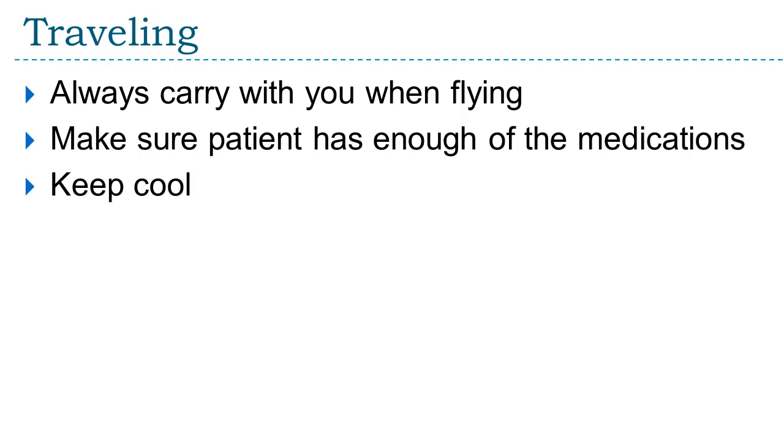It's usually administered at a basal rate of about 0.5 to 2 units per hour. And after a meal, a dose of insulin is calculated based on the amount of carbohydrate that's ingested. Usually, it's set to deliver 1 unit of insulin for every 15 grams of carbohydrates.